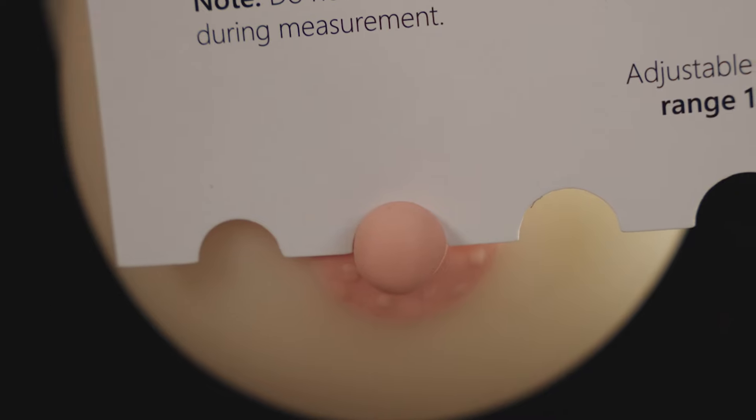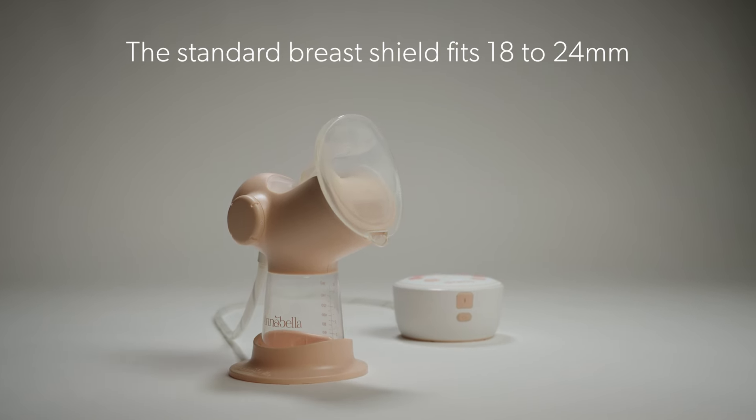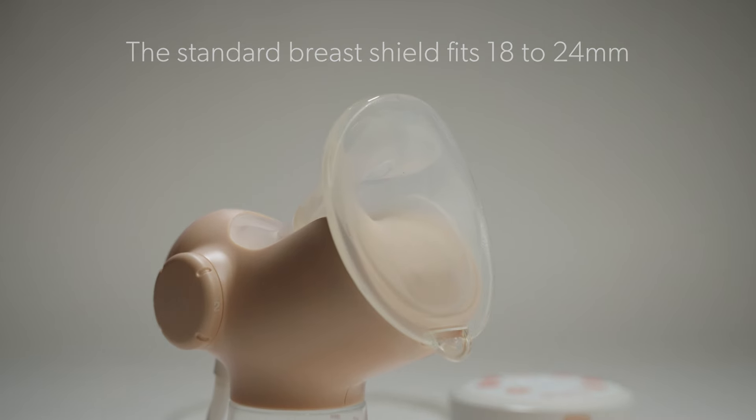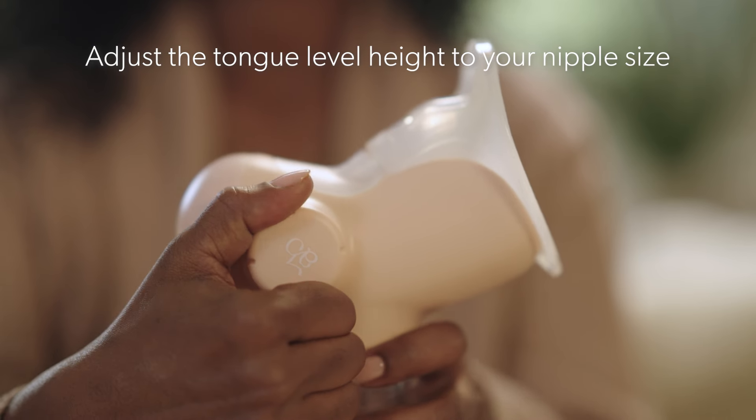If your size falls within the range of 18 to 24 millimeters, you're all set with the standard breast shield that comes with your Annabella. Adjust the tongue height to your nipple size.